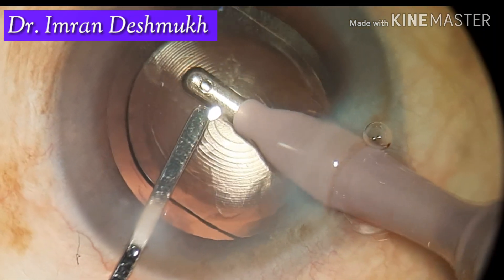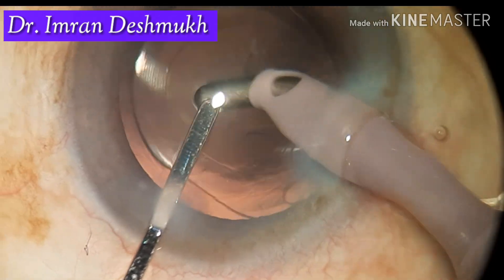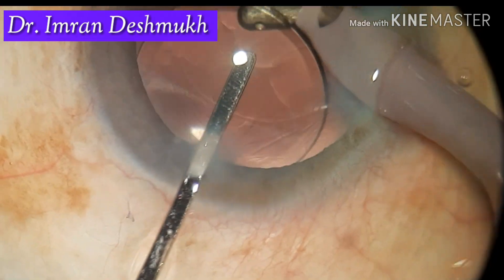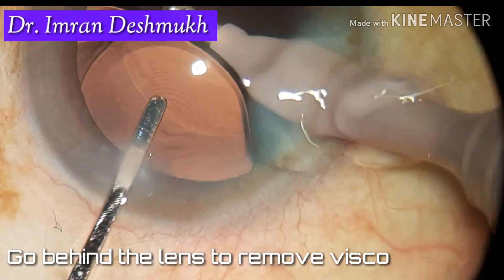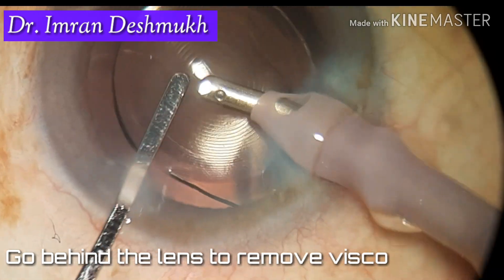You can also use the hydro-implantation method of inserting the IOL in the bag — it can save time. However, I usually follow my own technique: I go behind the lens and try to remove as much viscoelastic as possible, whether it's a hydrophilic or hydrophobic lens.